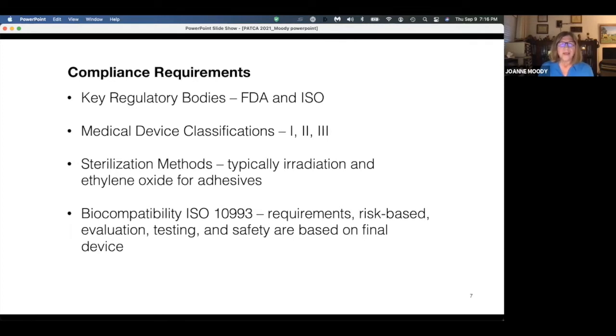And early on, many of the devices are going to be class 2 if the data is going to be used directly to determine next medical steps. So the diagnostic side is class 2. Many of the devices are moving in that direction. Even if they're not ready yet, they're trying to get the materials ready.